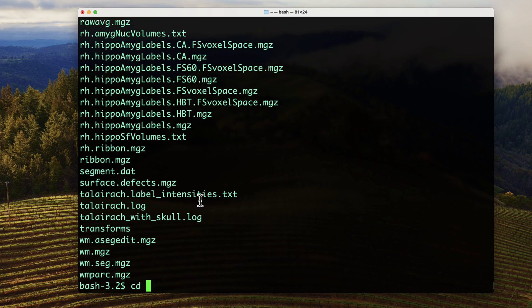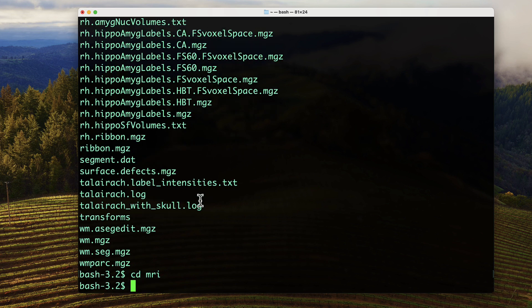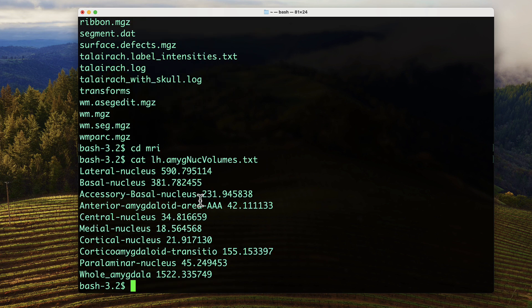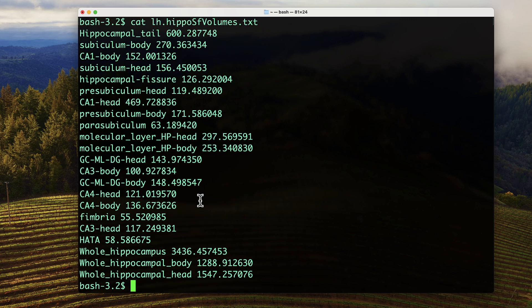The files lh.amygNuclVolumes.txt and lh.hippoSfVolumes.txt contain the cubic millimeter volume estimates in the left hemisphere for each sub-region of the amygdala and the hippocampus, respectively.